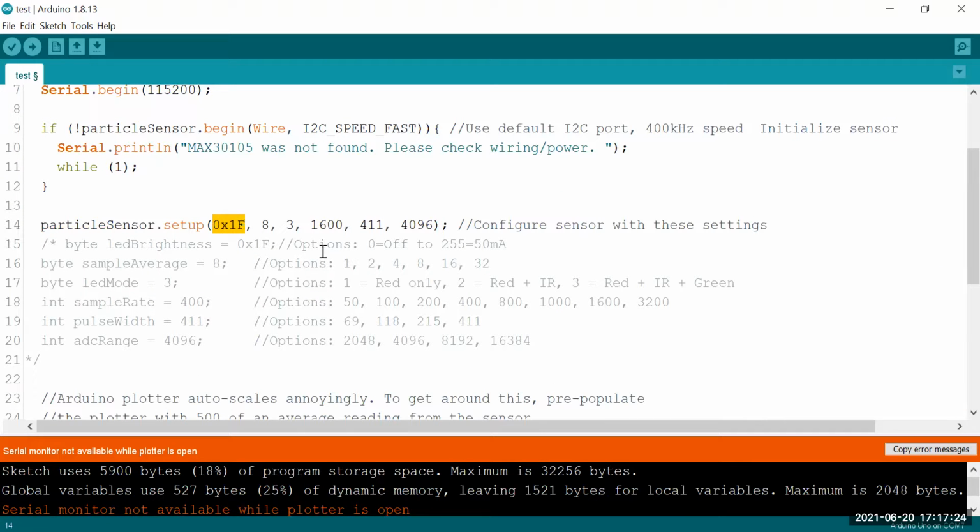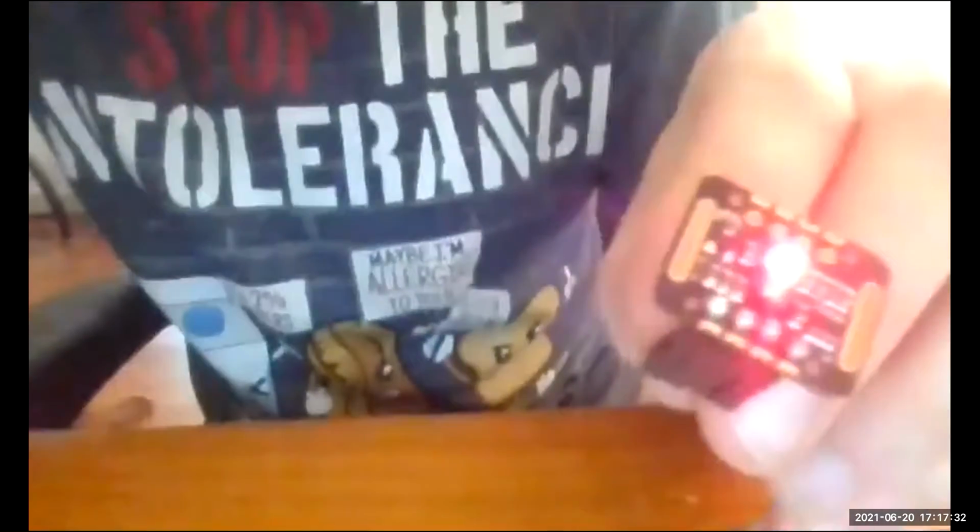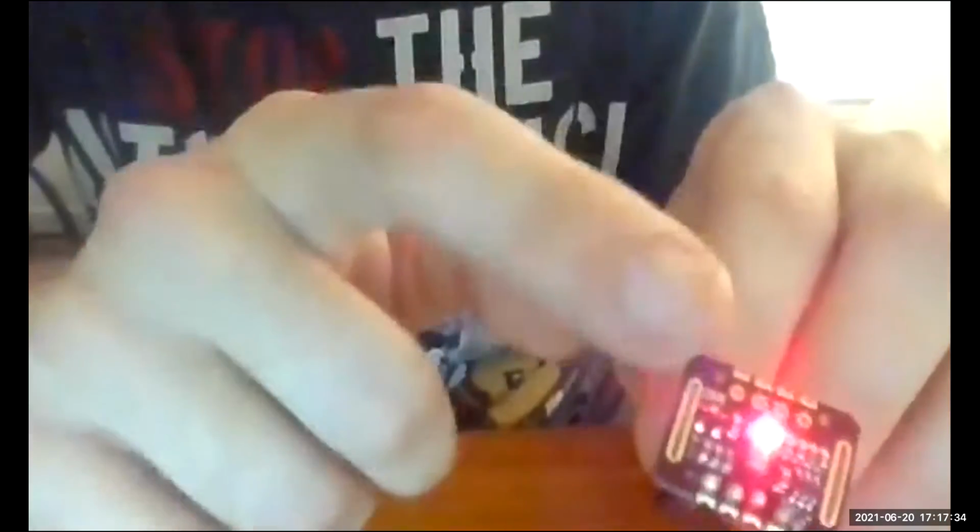This first cell is defining how bright the LED is on the light. Let me show you what that is. That's the brightness of this light in here. There's several different LEDs of different colors, and we'll talk about that in a second. Let's go back to the code.